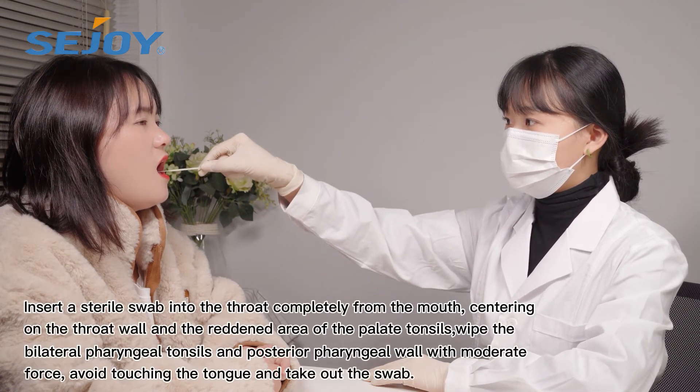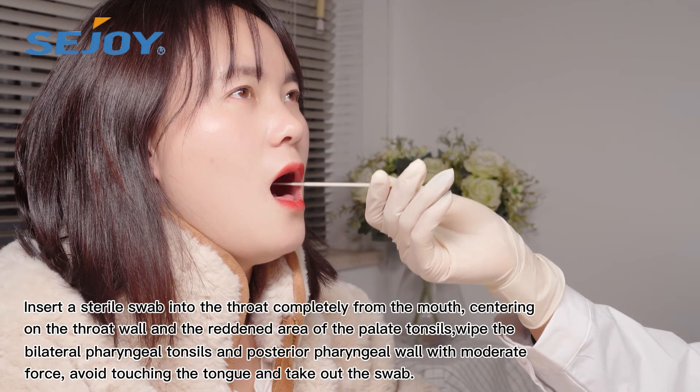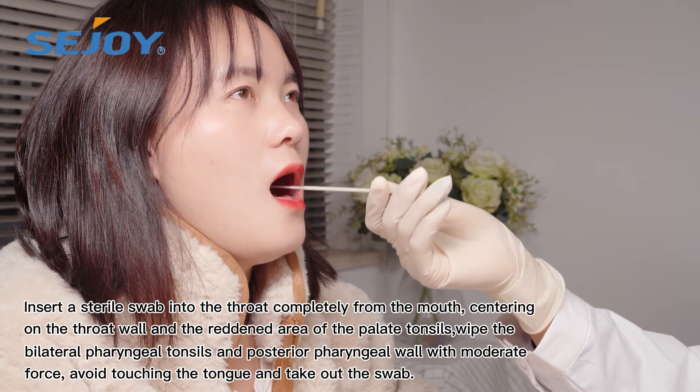Insert the sterile swab into the throat. Wipe the bilateral pharyngeal tonsils and posterior pharyngeal wall with moderate force.